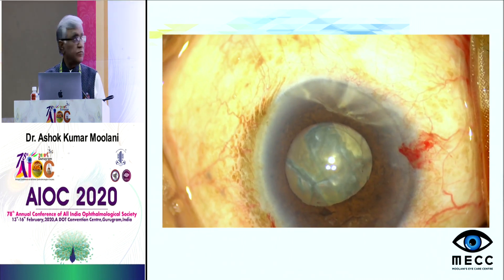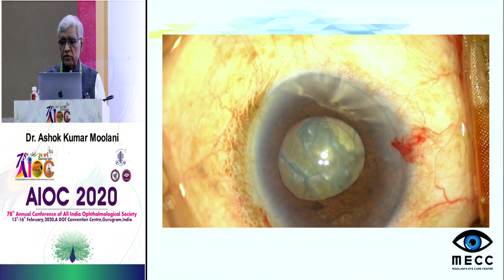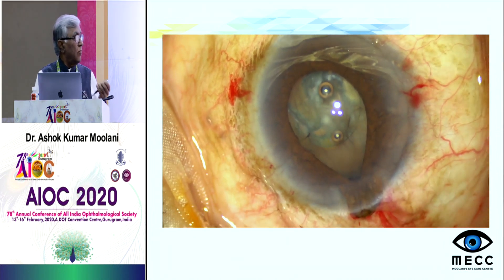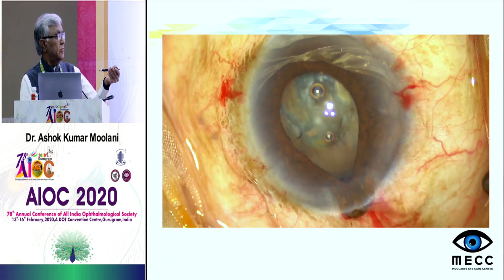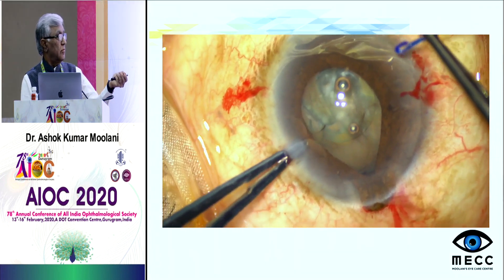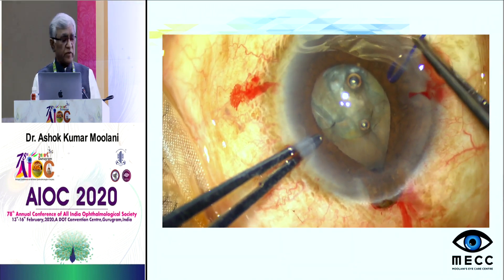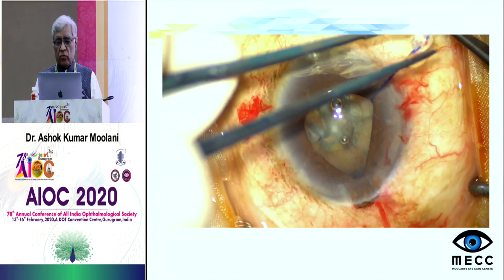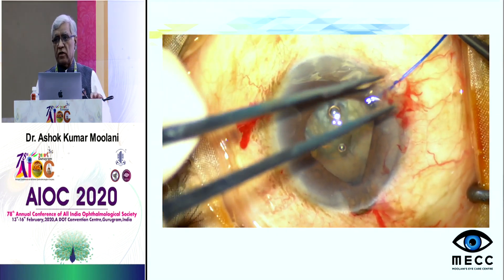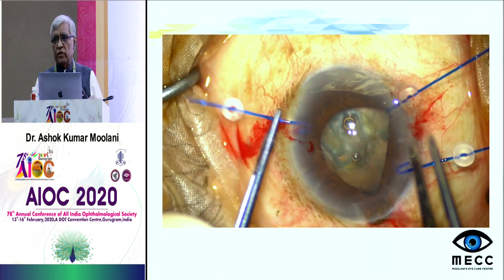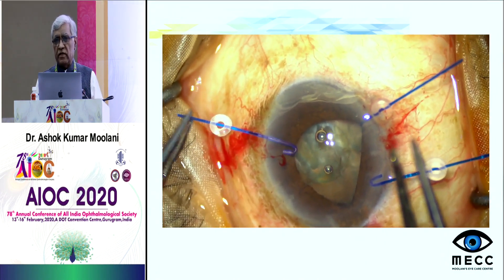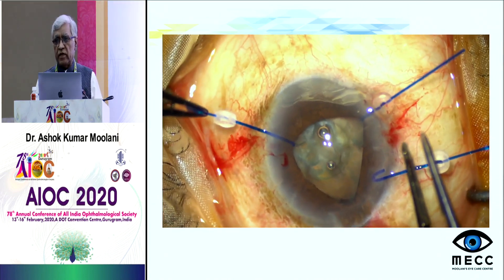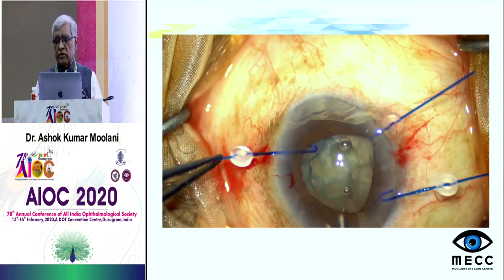Here is a patient with IFIS syndrome where there is prolapsing of the iris. You can see the prolapse occurring from the main port. I am managing this using iris hooks. When using iris hooks, you must place them parallel to the iris. If you indent them from the corneal side, you will get tilting of the iris and restriction of management with obstruction from instruments.